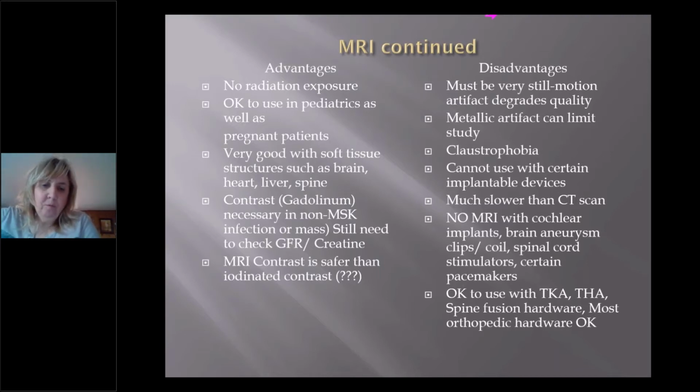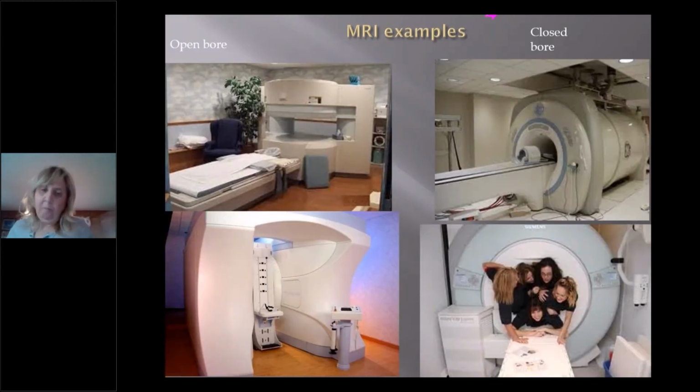But at the end of the day, I wanted to give you some parameters of, hey, it's okay if you had a knee replacement. It's okay if you had screws put in your wrist for a broken wrist. It's okay that you had shoulder surgery or whatever to get those studies. Again, when you're not sure, reach out and ask the rads before ordering it, so you're not wasting your time and money and all that nonsense.